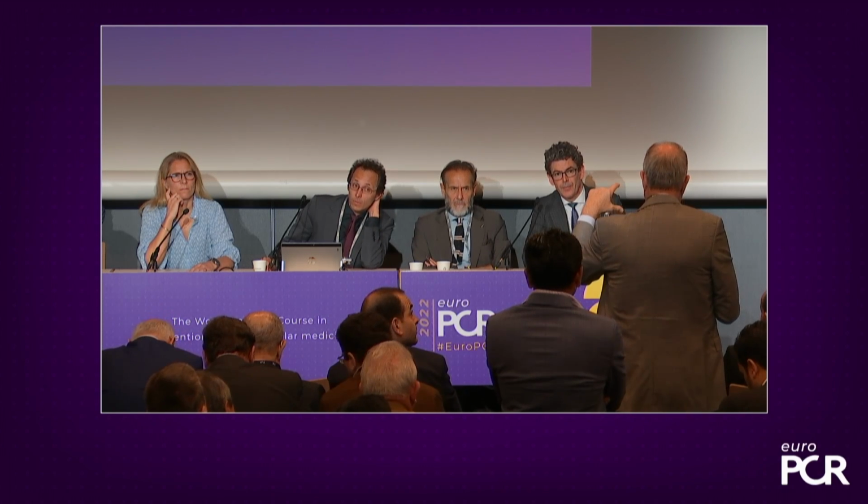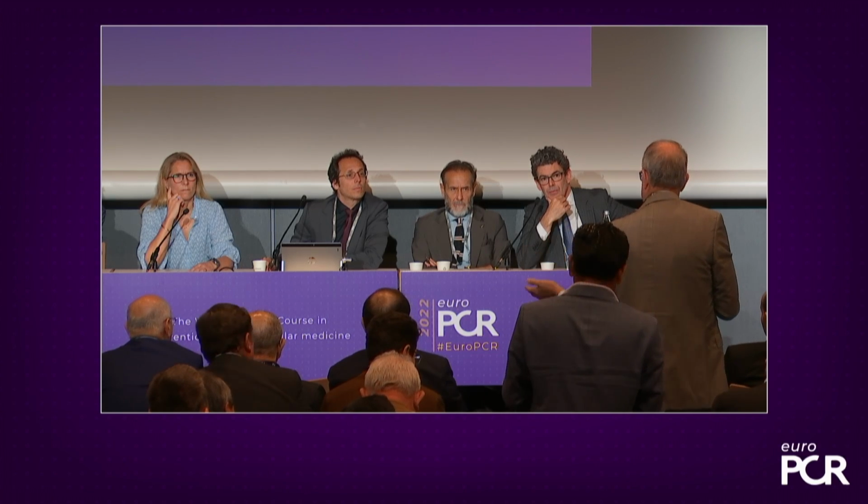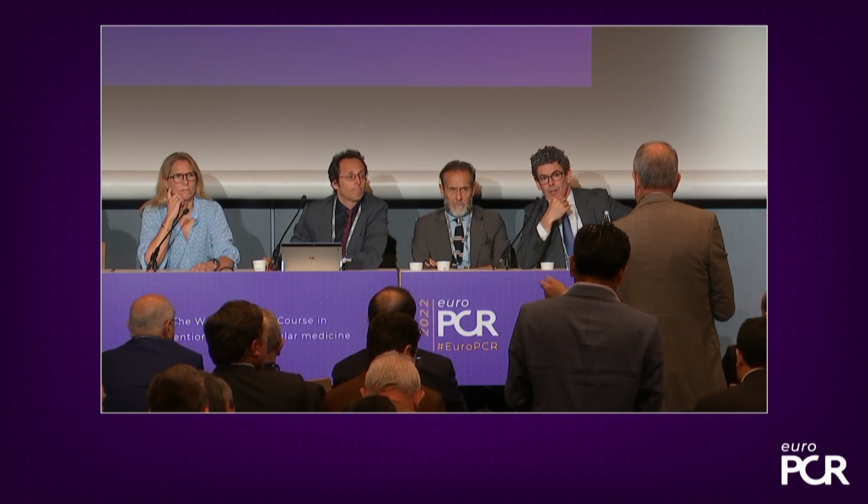But my comment, though, is that there's another alternative approach: if you have full balloon expansion, why do any lithotripsy in that area? Once the balloon gives, you've increased the compliance of the area. Why continue to give pulses? Why not take a more conservative approach? Do we know which of those two philosophies is correct? Is there any data to support those two opposing philosophies?